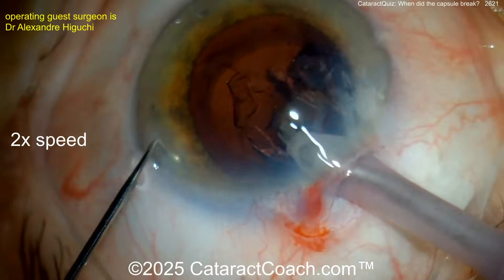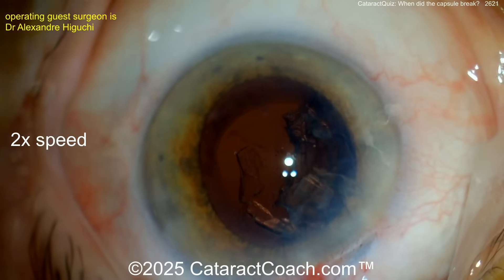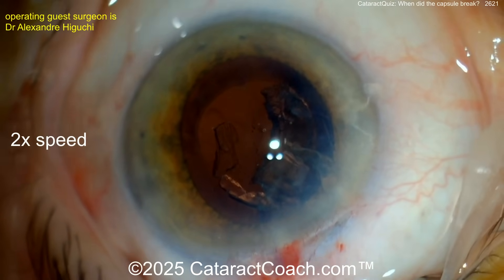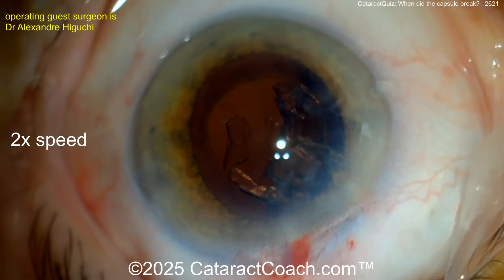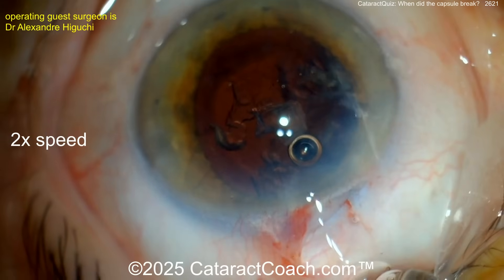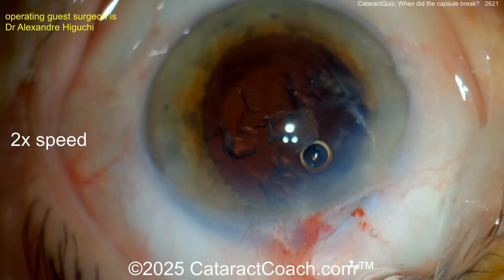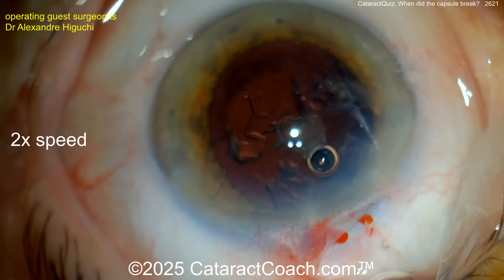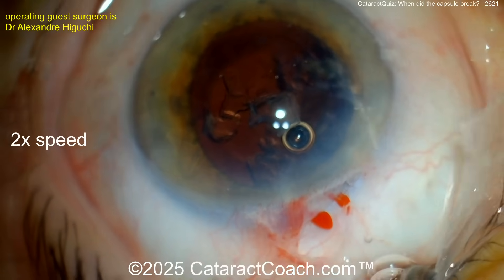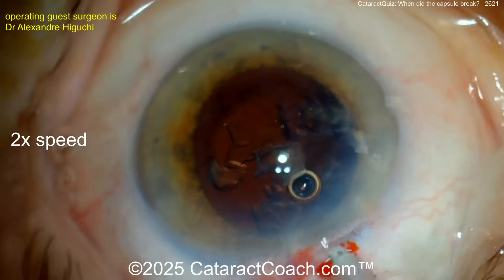Bringing those pieces around with a sharp tip chopper, getting those out with the IA probe. This is where it gets more challenging — let's watch carefully. A little viscoelastic, always a good thing. Get those pieces centrally located. Remember, a broken capsule is a common complication — it happens to everyone.